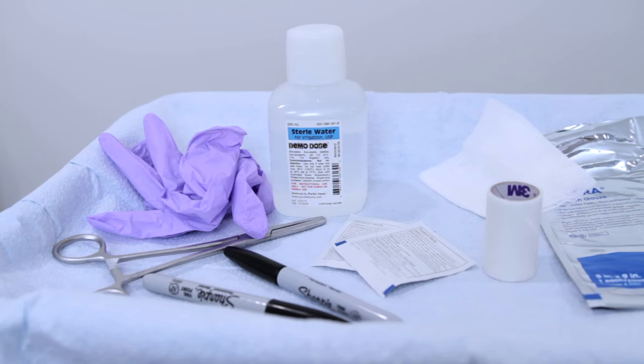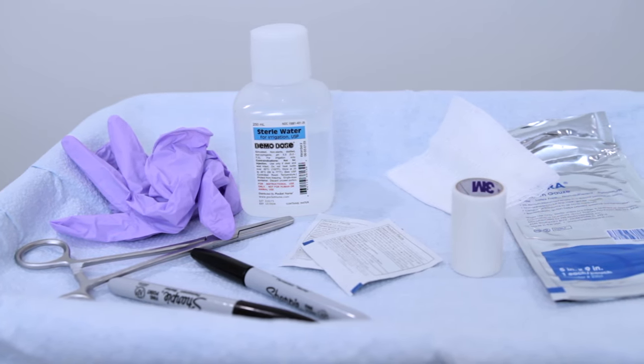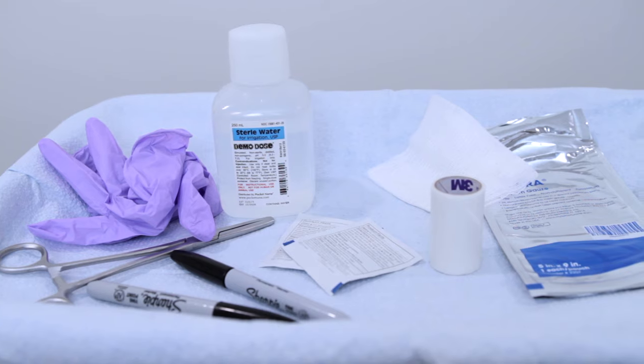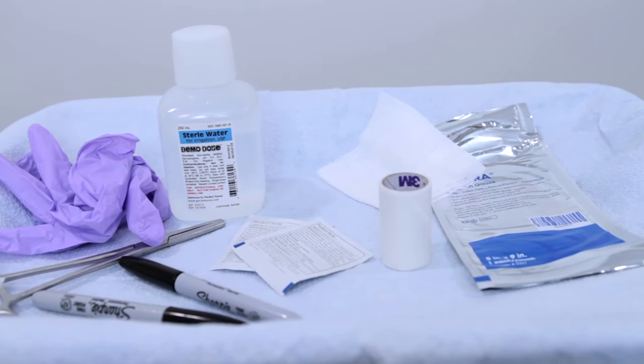The supplies that you should always have at the bedside consist of gloves, Kelly clamps, sterile water, your four-by-four gauze, Vaseline gauze in the event you lose placement of the chest tube from the patient's chest, and some tape.